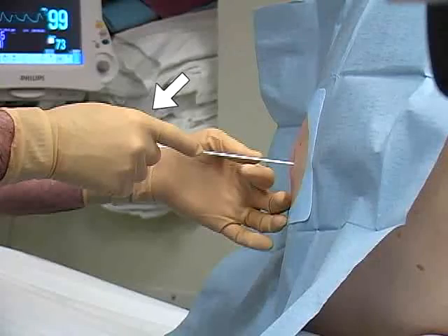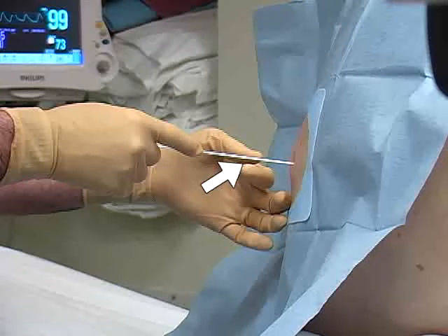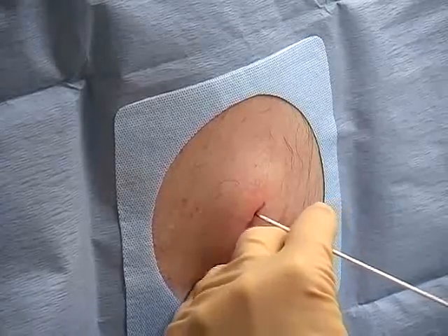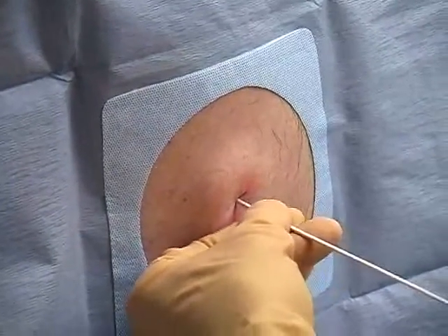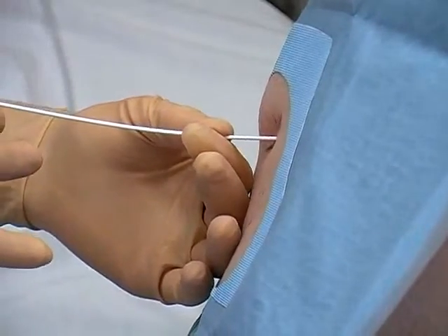Hold the back end of the catheter in your dominant hand. Rest the dorsal surface of your non-dominant hand on the patient's back and use the thumb and index finger of this hand to steady the shaft of the needle. Insert the tip of the needle into the skin nick and advance the catheter until it comes into contact with the rib. Then slowly walk the catheter over the rib.